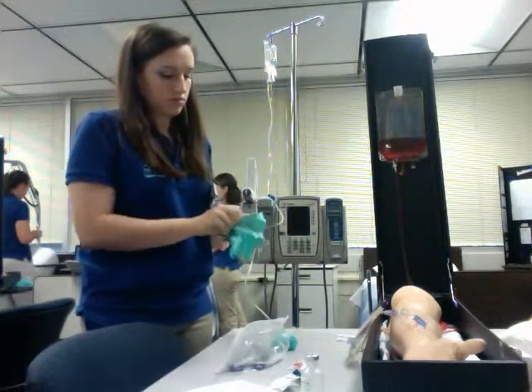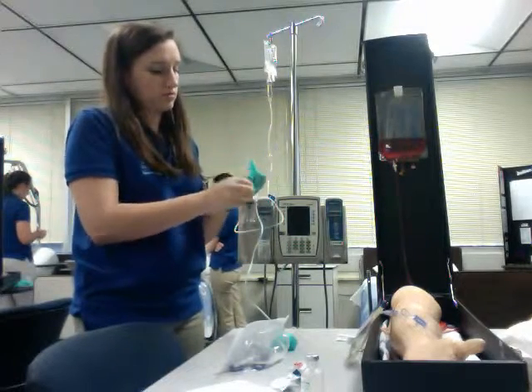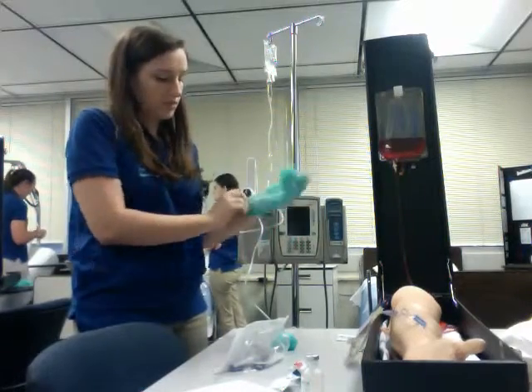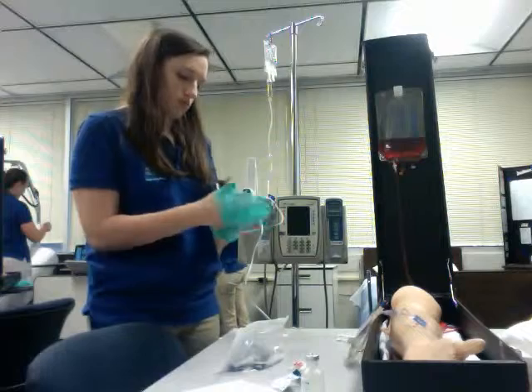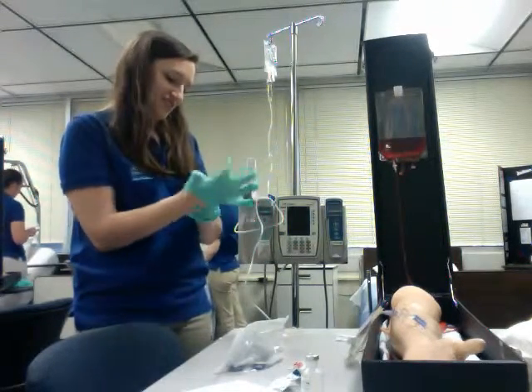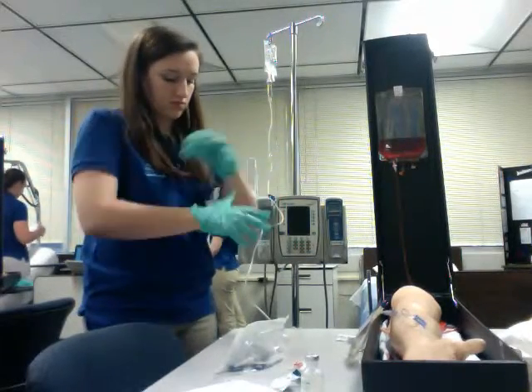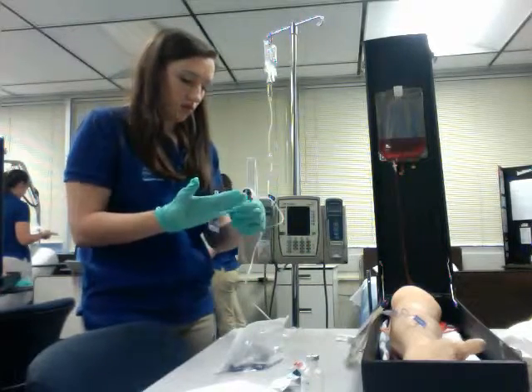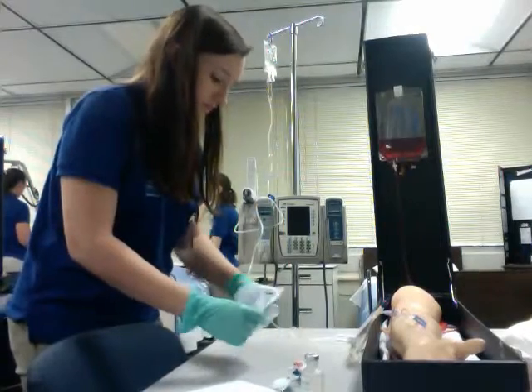Treatment of serious infections in susceptible organisms, designed to disrupt the bacterial cell wall membrane, causing the cell's death. Also, check the patient's allergies. Side effects are seizures, anaphylaxis, pseudomembranous colitis, and serum sickness. Before I gave the medication and while the patient was receiving it. Before I gave it, I did the culture and sensitivity test, and now I'm going to go ahead and get my tubing ready.